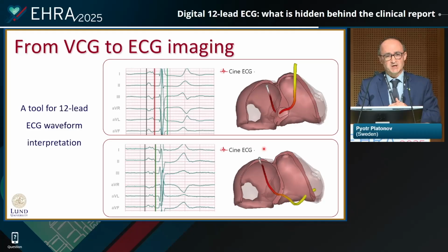Newer techniques are coming, and Cine ECG is one of the new kids on the block that came a couple of years ago, and again, is becoming exceedingly used to visualize propagation spread. Here is an example of 2 P waves in the frontal plane expressed in the standard leads. Those who can read ECG can probably identify that this is a case of advanced intra-atrial block.